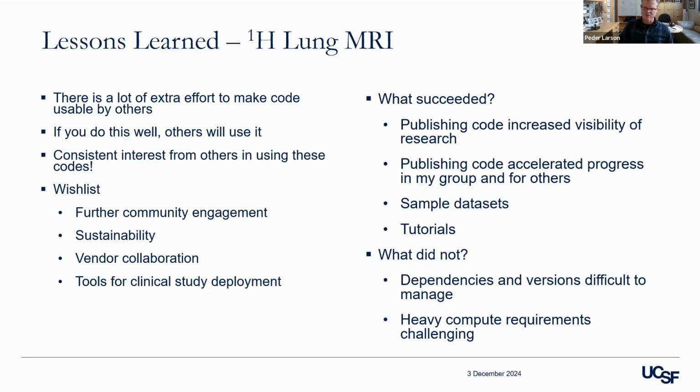I mentioned the challenge, like I think having good tutorials, sample data sets has been key. Dependencies, versions, man, I hate that, but it's going to be there. And these projects in particular have pretty heavy compute requirements, and so Colab sometimes has not worked very well for these because what you get is limited. That's still a little bit of a challenge.